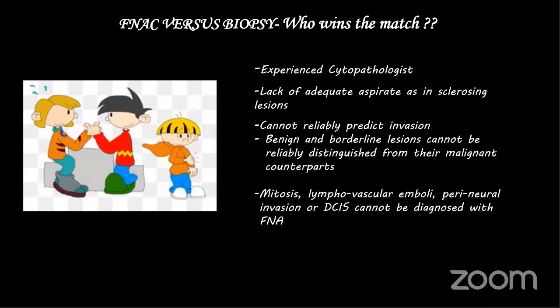Now a word about what is FNAC and what is biopsy and what should we do, who wins the match. Always I have seen in practice that clinicians tend to refer patients for FNAC of the breast, and even radiologists refer for FNAC. So FNAC is fine needle aspiration cytology, which is performed by a thinner needle, and we just suck out some cells and or fluid if present within the lesion, and then we send it for examination.